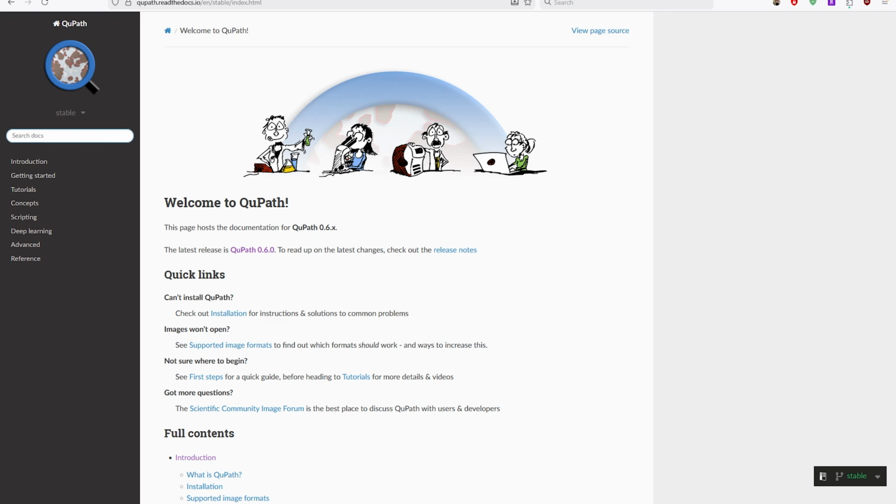After that, we discussed how to use the pixel classifier, train it, and load it later in other slides and annotations to be classified. Finally, we mentioned how to export the annotations and results, whether using the export measurements tool or the GeoJSON export tool. In the end, we covered how to navigate the documentation to gain more tutorials or to read more about the different concepts or how to use any of the discussed tools.